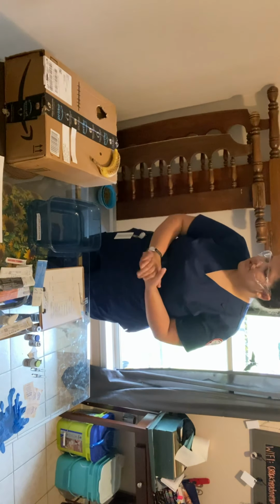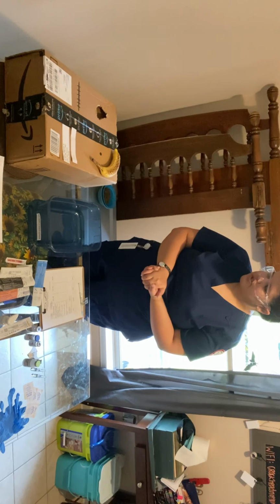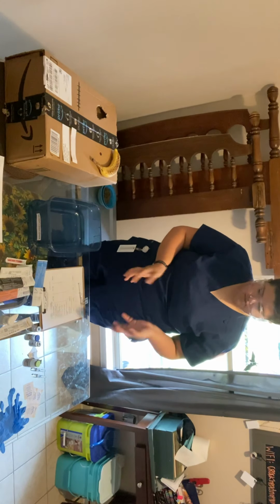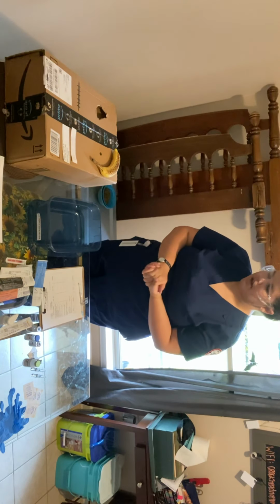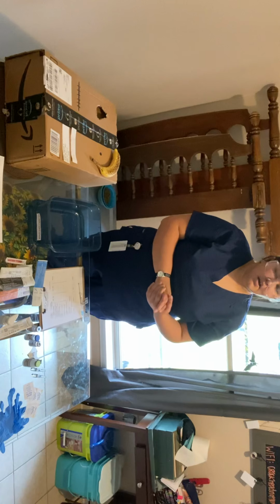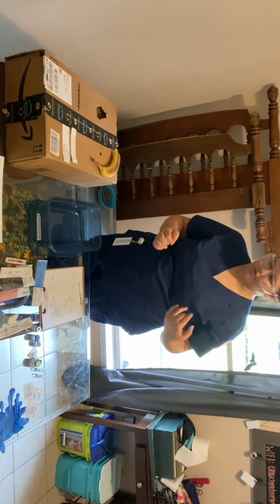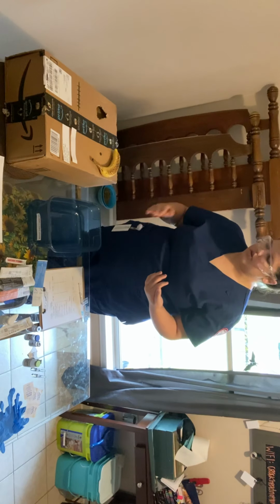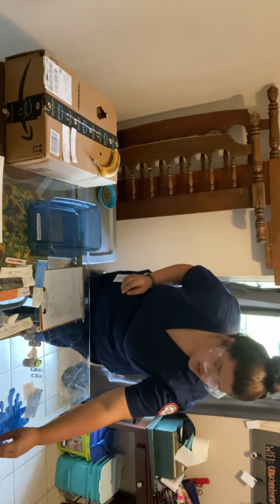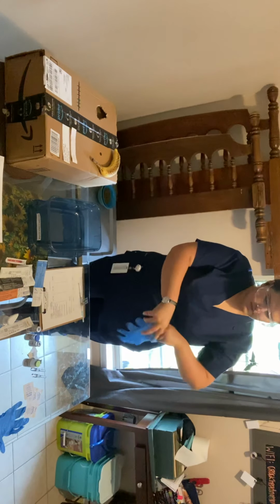I see you're allergic to penicillin, Mr. Jones. What kind of reaction do you have? Okay, well, I can assure you that I won't be giving you penicillin today. I will be giving you heparin in your abdomen area, and you should just feel a slight prick, but I'll let you know it's going to happen. Okay, at this point, I would raise the bed completely and lower a bed rail. I'm going to put on clean gloves.